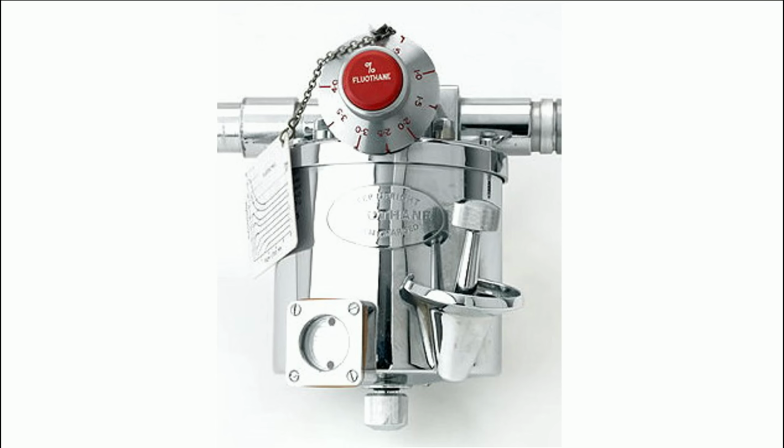Anesthesiologists therefore required a vaporizer that could reliably deliver a precise concentration despite changes in fresh gas flow and operating room temperature. The Fluotec represented a major engineering advance. It incorporated the key principles that are still found in conventional vaporizers today: a temperature compensating vaporizing chamber, a variable bypass system to control how much fresh gas entered the chamber, and a calibrated concentration control that allowed reproducible delivery of volatile agent.